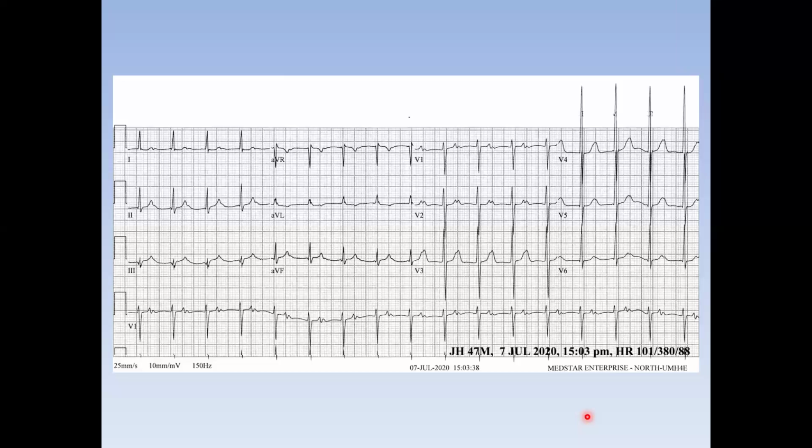And the other thing that you look at is the discrepancy between the atrial rate and the ventricular rate. If the ventricular rate is adequate, the atrial rate would not go up as much, because the body thinks, I am fine with that rate. However, if somebody exercises, the ventricular rate goes to 70, but the atrial rate is 140. That means the body is saying, I need a little bit more heart rate, and the sinus node is the marker for that. So that's another thing that you can look at.